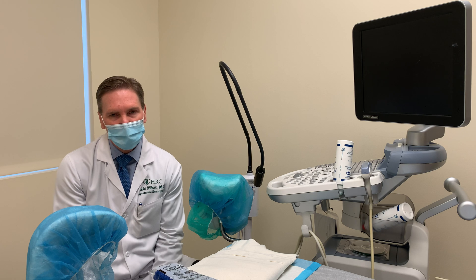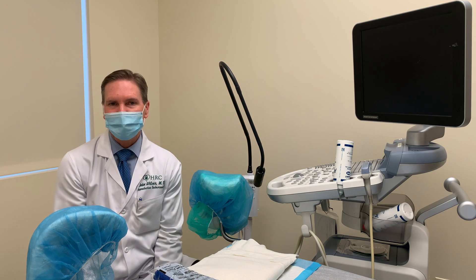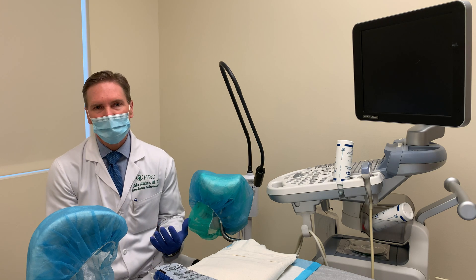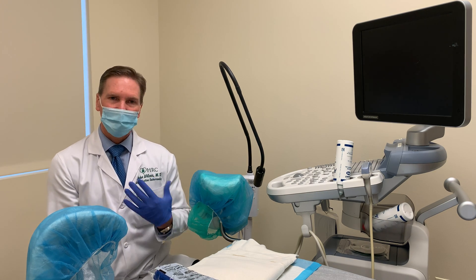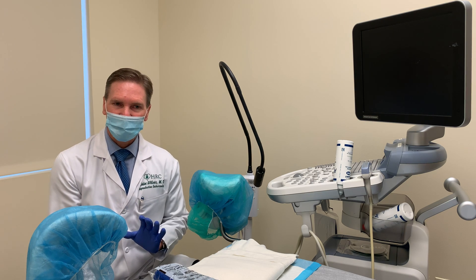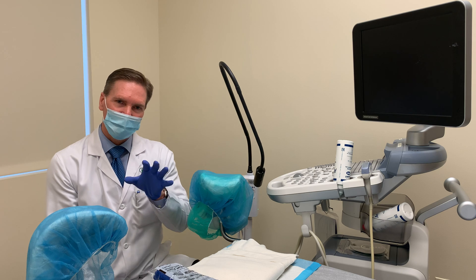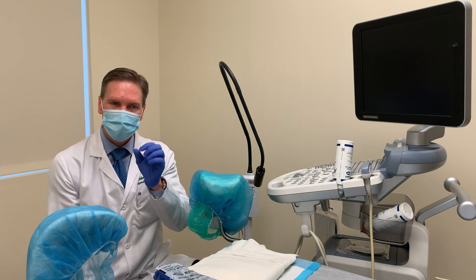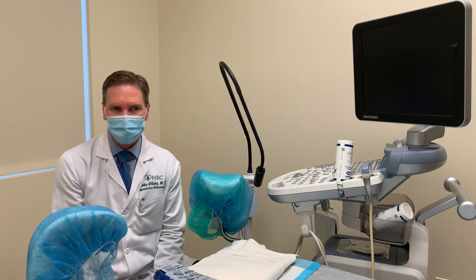Today it's a lot more precise — we don't do it blind, we do it under ultrasound guidance. We have an ultrasonographer in the room when we do the transfer. With a full bladder, the ultrasonographer puts the probe on the abdomen so we can actually see through the bladder and identify the endometrial tissue and see specifically the upper third of the uterine cavity.